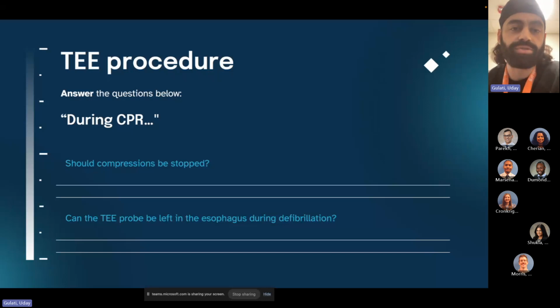These patients warrant a TEE because you can diagnose it earlier. Imagine this patient's in profound shock. You're not getting a good view, so you quickly put that transesophageal probe down. You immediately identify that there's a huge vegetation that you didn't see in your transthoracic view. You can just take a picture of that, record it, send it to your interventionalist. You can leave the probe in there if you need to, so they can see it themselves. You don't have to wait for a CT scan. You don't have to wait the next day to get a formal echo. And you can send that patient to the OR the same day, because there's an indication for intervention for this patient, for example, a profound shock state. So a lot of useful cases for this.